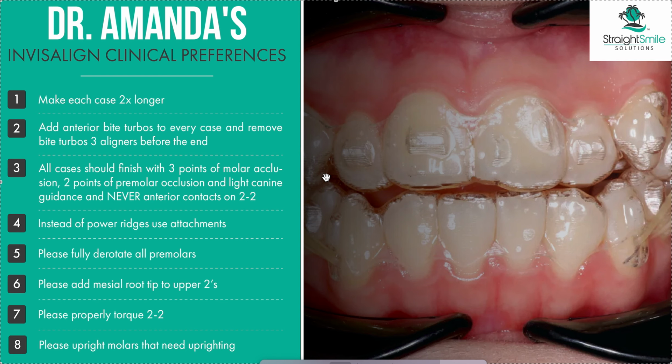Now, in the olden days when we had really, really well-made Hawleys, that kind of was the deal. I mean, my Hawleys have been around for 2 decades. I've never had to adjust them at all, but I had really, really good ones made, right? A little more expensive than a Vivera, but that's what I wanted and that's what I chose.